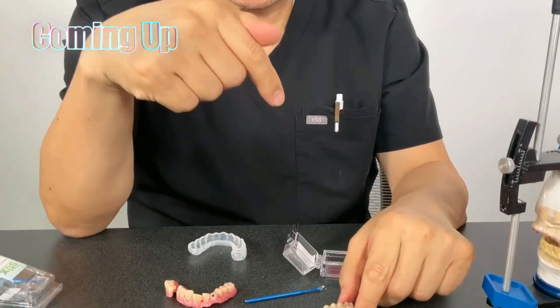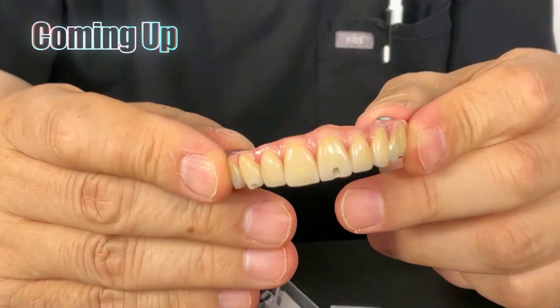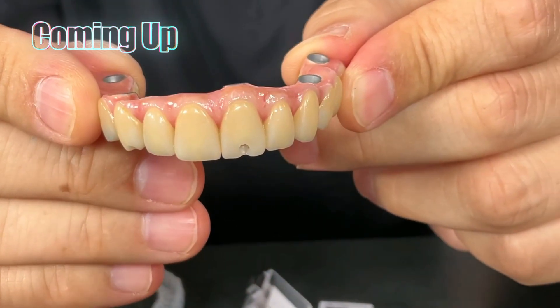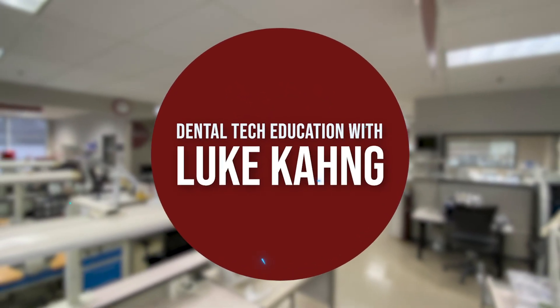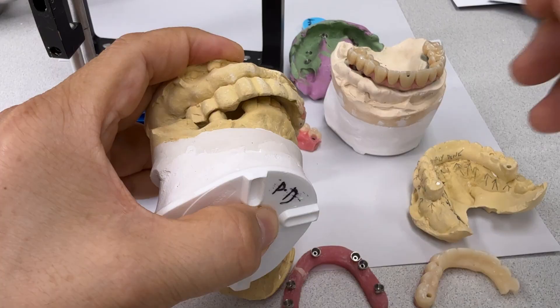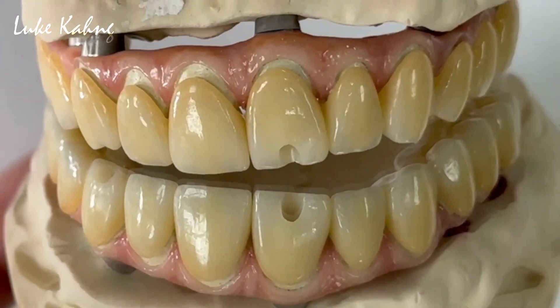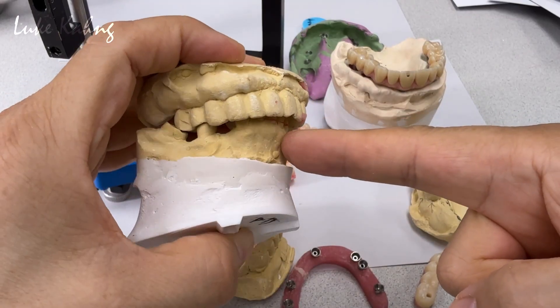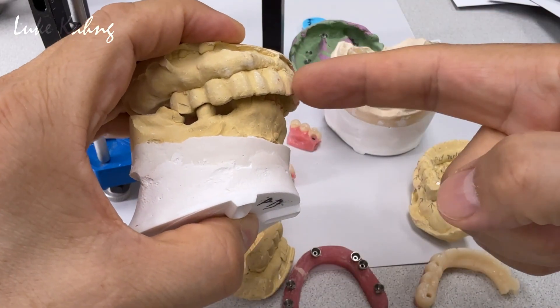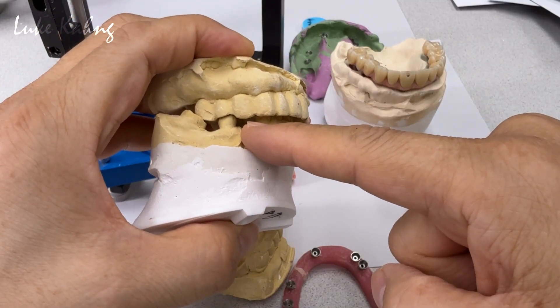We fabricated beautiful, just like natural dentine — a natural, lifelike restoration. This is the Seven Star case after placing the implants. This is an overjet Class 3 bite, so we were trying to bring it in as much as possible and increase the vertical dimension a little bit.